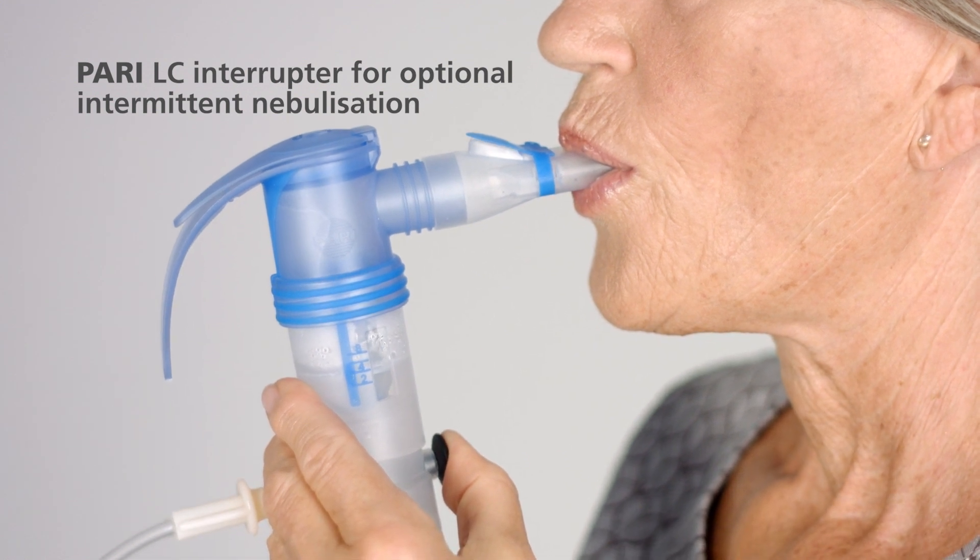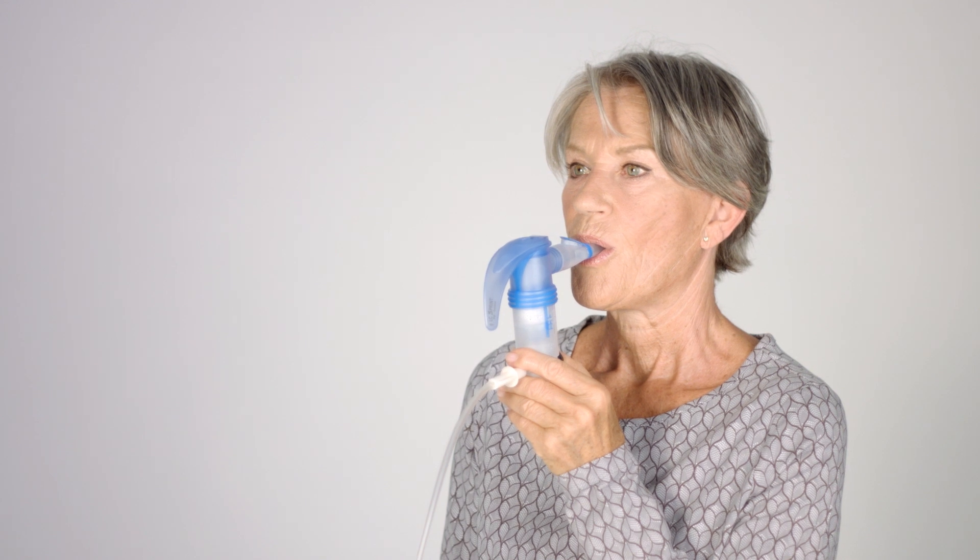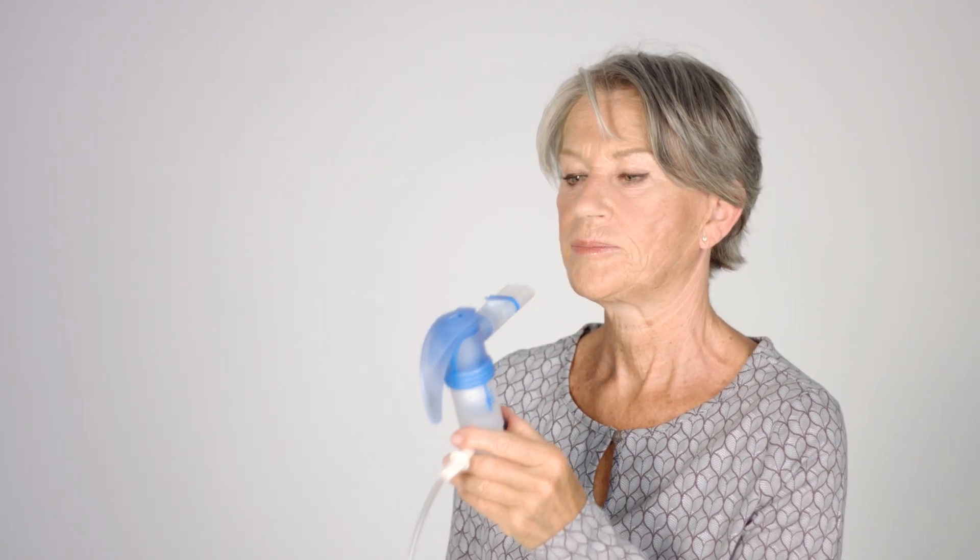With the PARI LC interrupter you can also carry out intermittent nebulisation. When a different noise comes from the nebulizer, this indicates that nebulisation has finished.